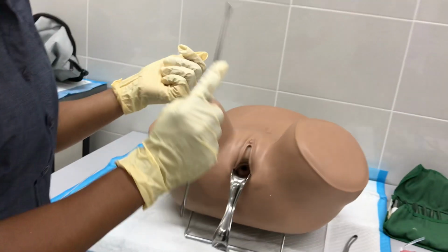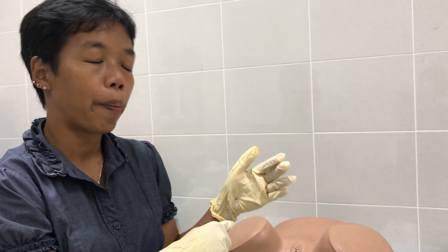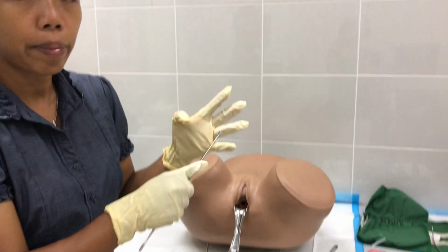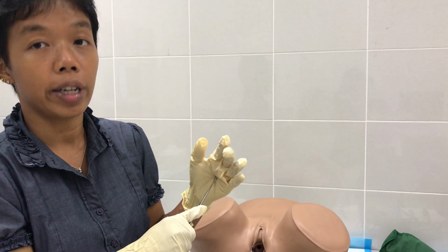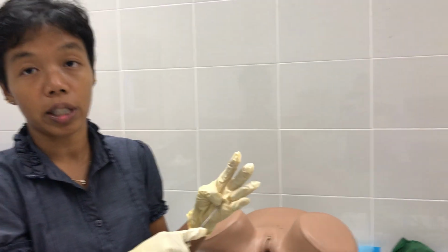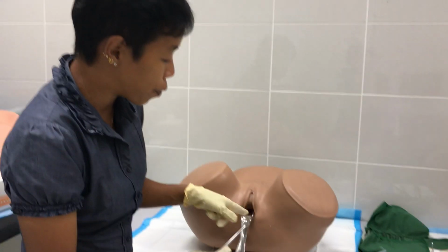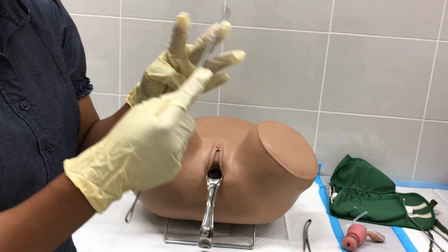So when you are doing it, how do you know that the product of conception is finished, or that you are taking too much tissue? How will you know? There are some signs. One is if you get a gritty sensation, that means your POC is already finished, which is like you are already hitting the endometrium. So at that time, you should stop the procedure. If you continue doing it, you are thinning all the endometrial layer. Then air bubbles, you can see the air bubbles coming from the cervix. So if you get air bubbles, you are having a gritty sensation.